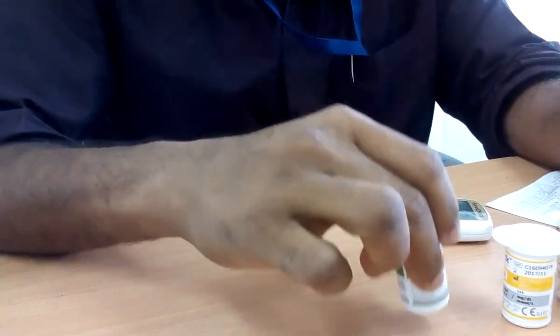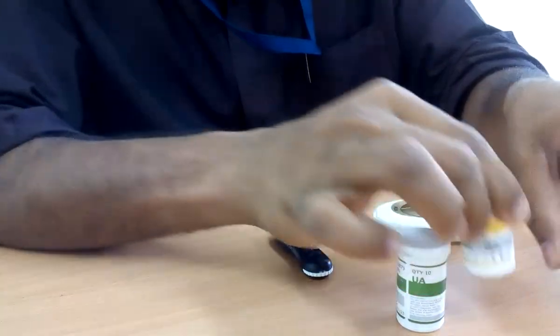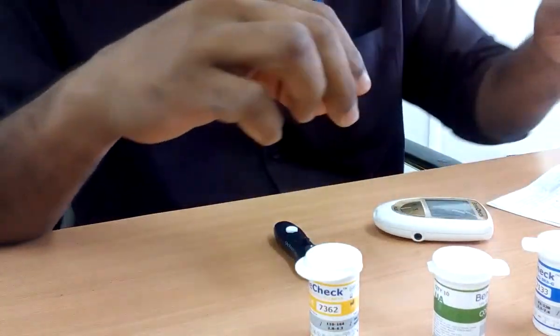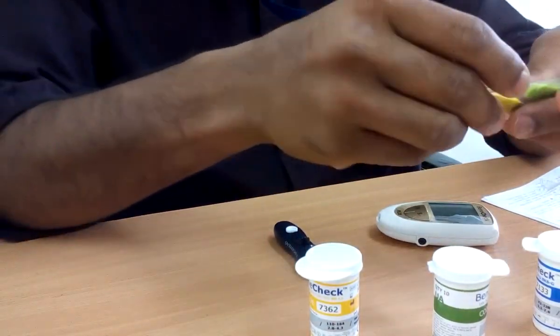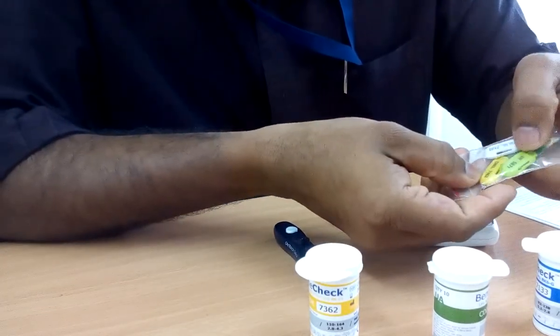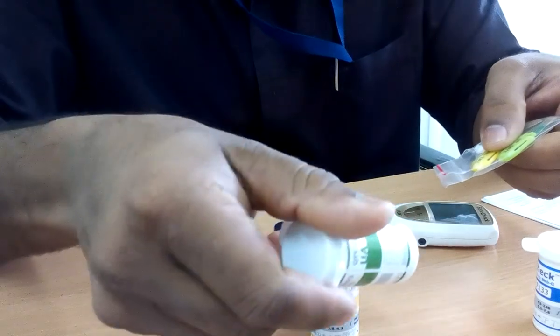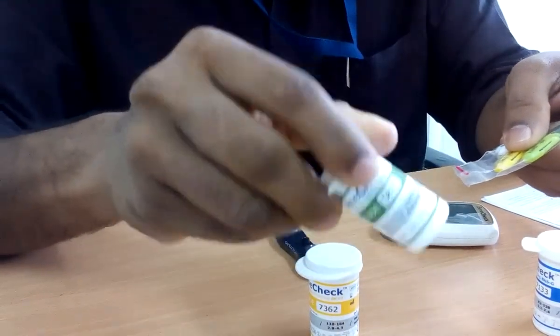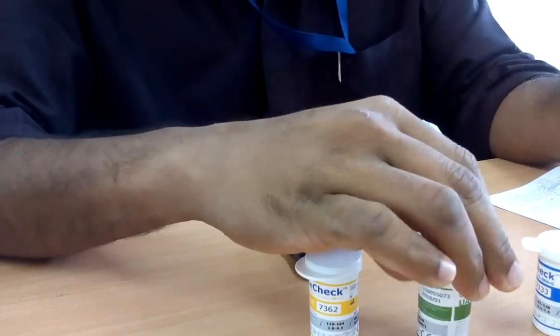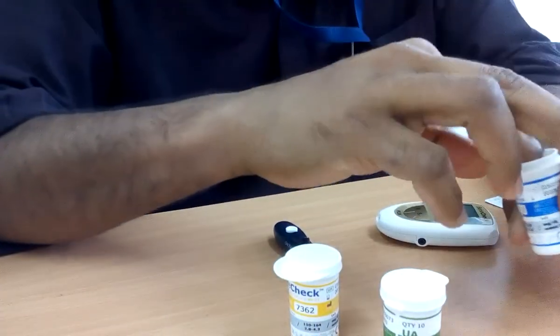Here are the three types of strips: this is for glucose, this is for cholesterol, and this is for uric acid. Each one — cholesterol, uric acid, and glucose — has different code numbers, which should match or we have to change accordingly to the strips. While inserting, we will come to know more about the proper numbers.